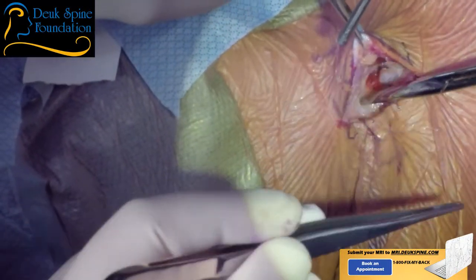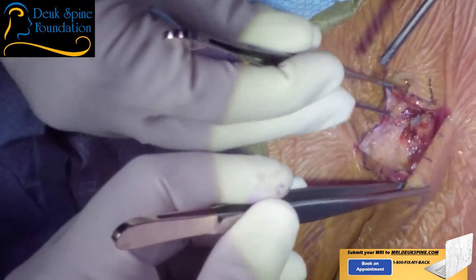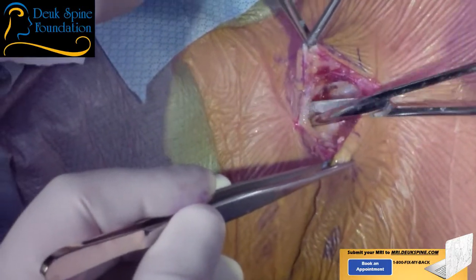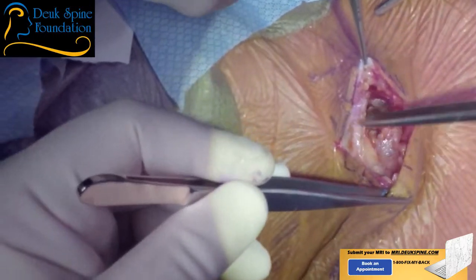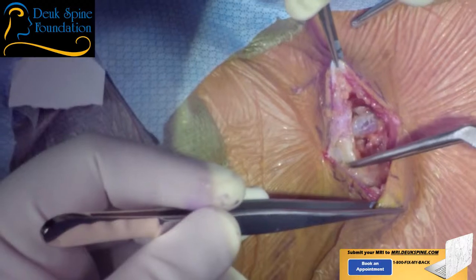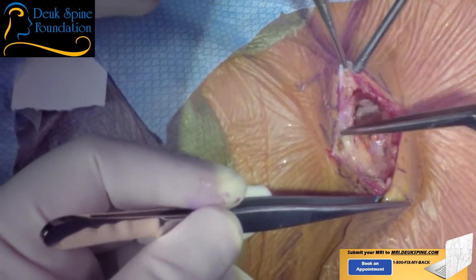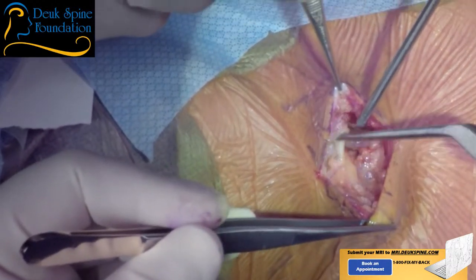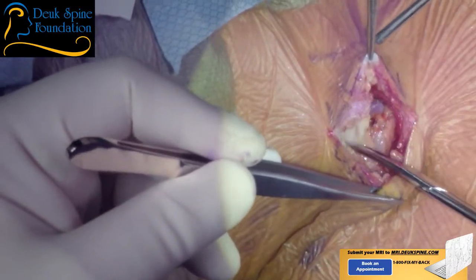Now once again, normally for a single level, I wouldn't do an oblique incision, but because of the thickness of his neck and the poor visibility with the x-ray machine, I have to do an oblique incision. Otherwise, it will create problems later on in the surgery when we get down to the spine and I'm not able to see the proper disc levels. So in anticipation of that issue, I've opted for an oblique incision.